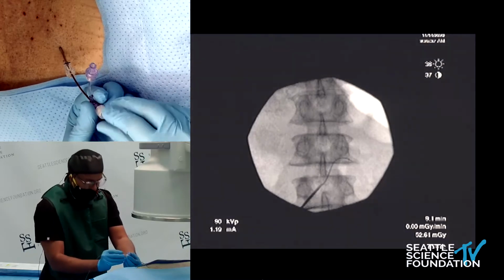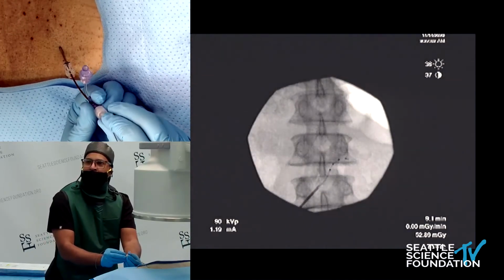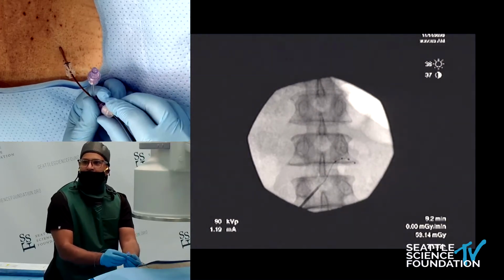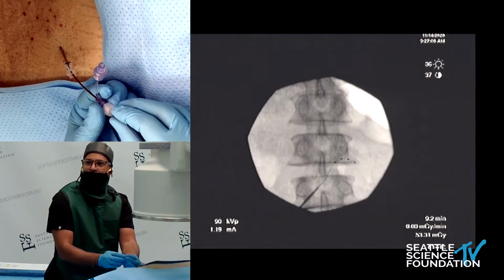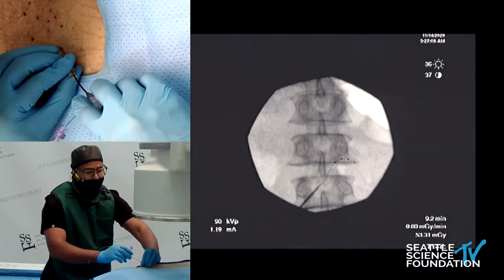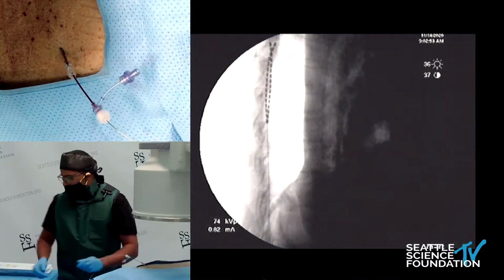Okay, and here comes the lead going through that sheath. You can see it wraps all the way through. See if I can push it out a little bit further. There we go. All right, so this is the ideal location, contacts 2 and 3, right underneath the DRG, or right underneath the pedicle, excuse me. Justin, let's check a lateral now. Let's make sure that this really has remained dorsal.